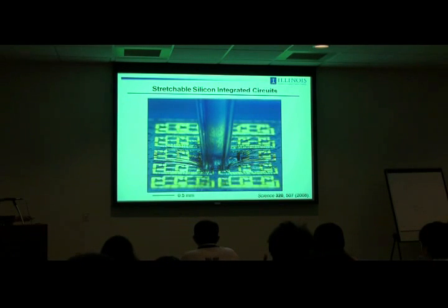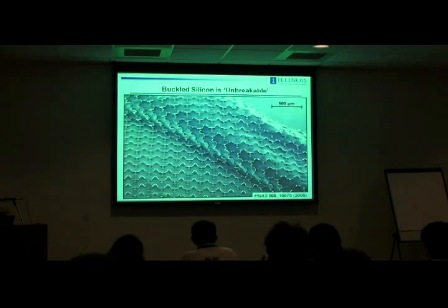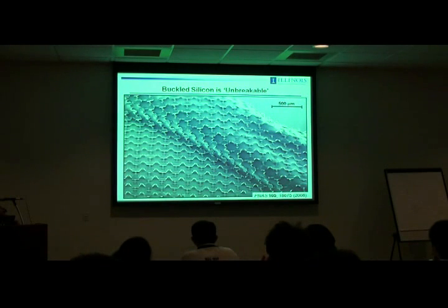So you can imagine if you continue to press this thing, this particular line is already flat. It doesn't have any geometrical ability to continue to stretch. And so it will fracture if pressed much beyond this particular level. So there's a finite range of stretchability in these systems that one can compute and then design around using approaches I'll describe in a second, or right now. So that's the idea. So there are two limitations here.